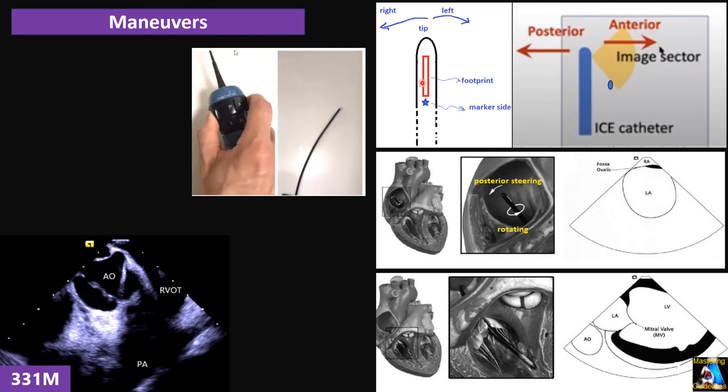The image B shows the movement of the eustachian ridge and the CTI during flutter and recognizes the anatomical challenges before starting the ablation. Image C corresponds to the same patient once the ablation of the distal aspects of the CTI has started close to the tricuspid valve end of the isthmus.